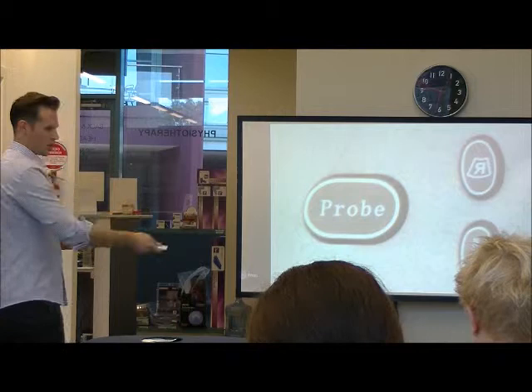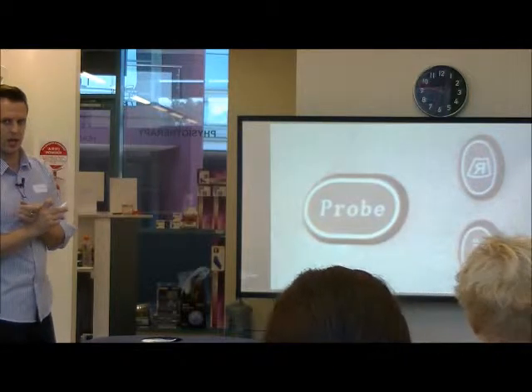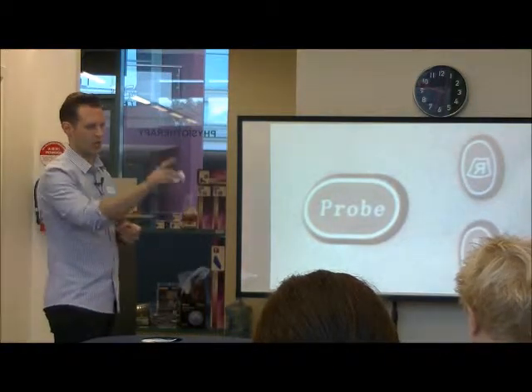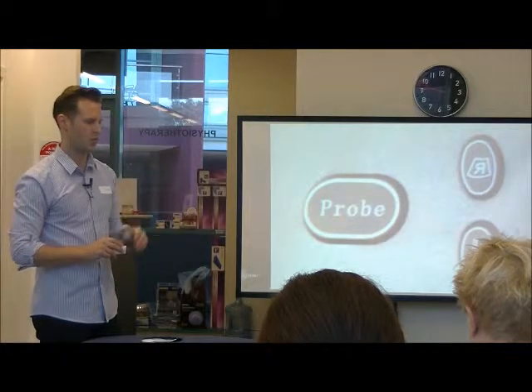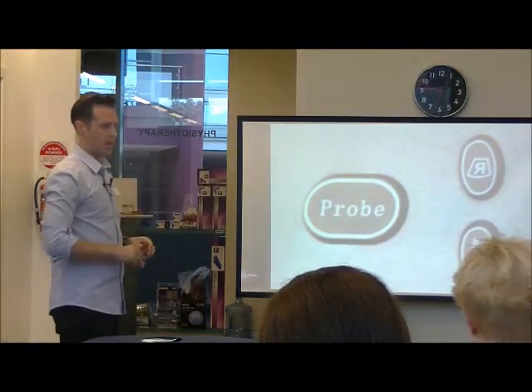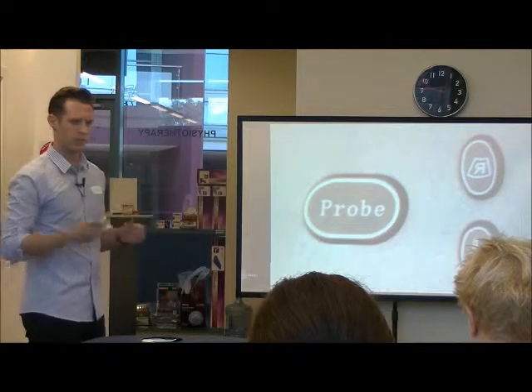In terms of probes, all of these units have two probes. The linear probe on our units are the high frequency probes. So we use these for our small parts. We're going to use the linear probes for our shoulders later. They all have presets when you hit the probe button, so you can choose between your small part, you can choose between your abdominal exam. Some of them have an orthopedic setting. And our convex probes, on the other hand, are our lower frequency, higher penetration probes. So we use them for the abdomen and pelvic floor.